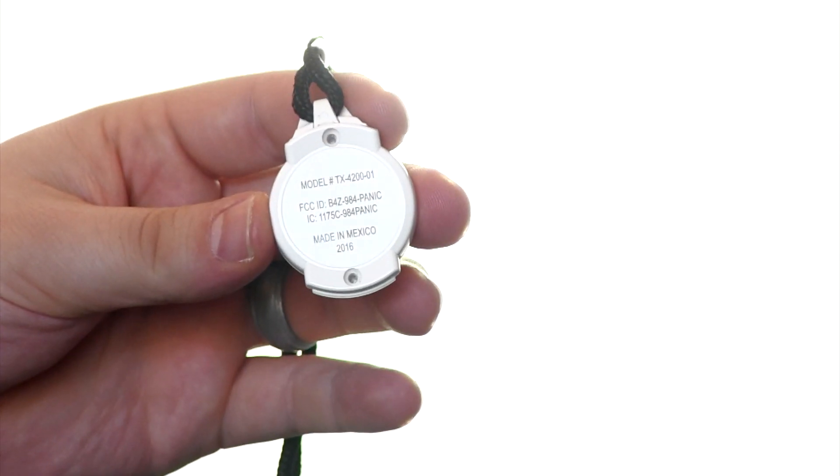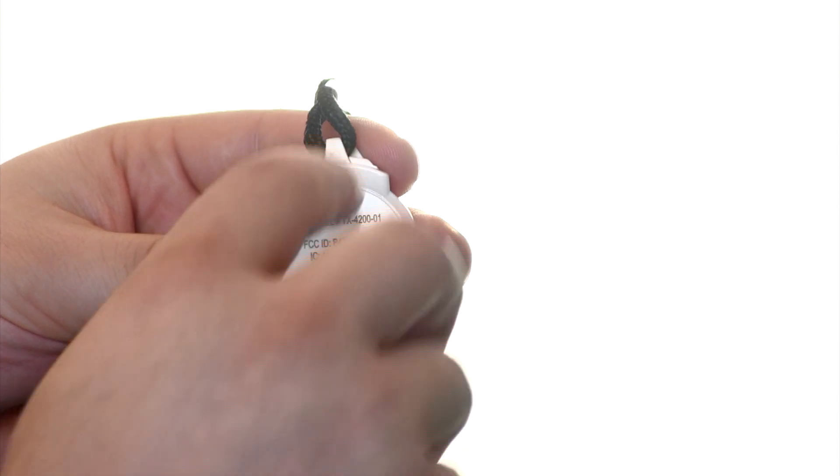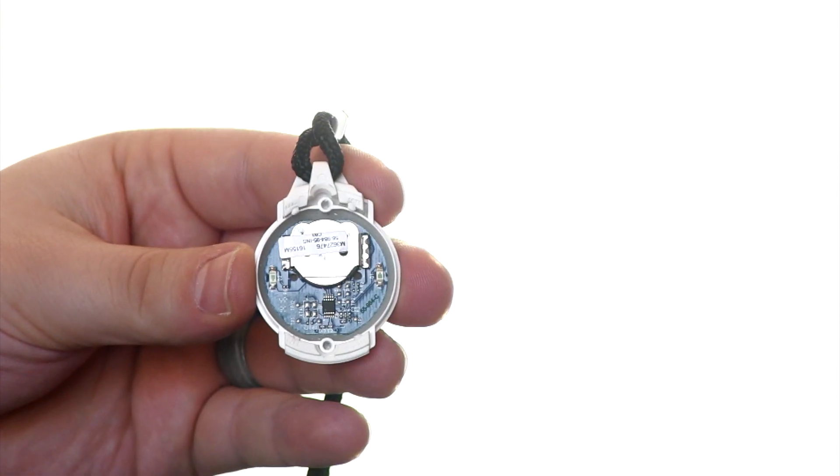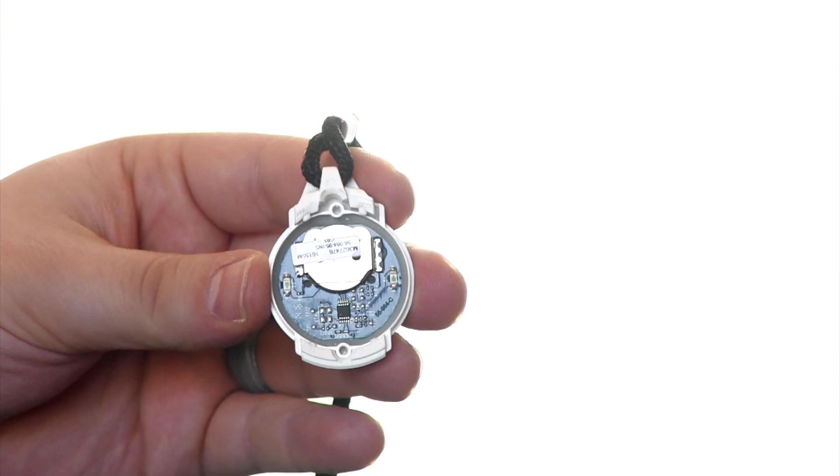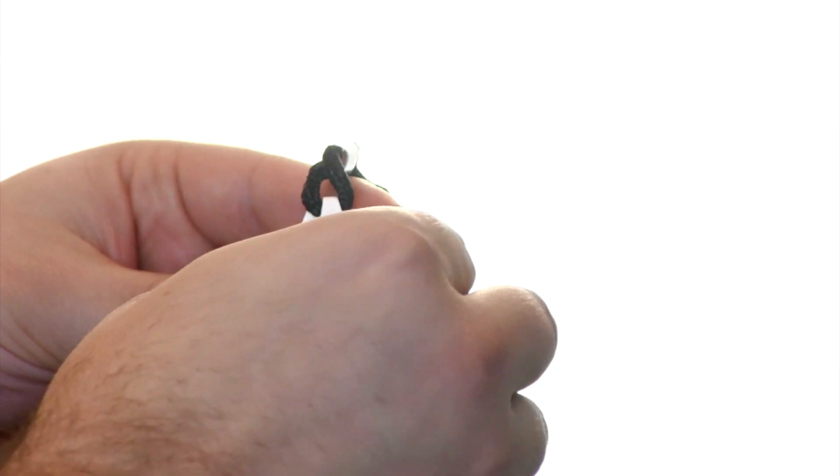Once the screws have been removed, we can pull off the back plate. From there you'll see inside to where the battery is housed. You can pull this part out of the device completely.